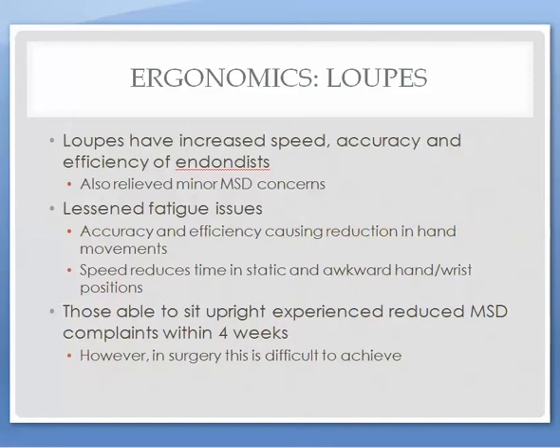Recent research has shown that sitting upright helped reduce MSD complaints after a 4-week period, but as seen on the previous slide, keeping the back straight in a surgery would be rather difficult to achieve.